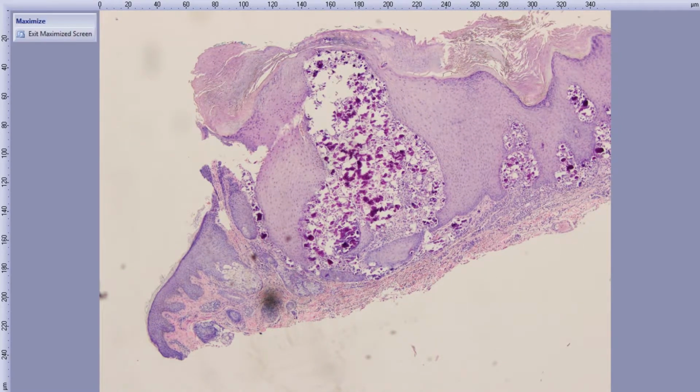In this particular case, there's an entity that occurs mostly in young kids, maybe teenagers, where primarily in the head and neck area, they get a random deposit of this calcium. And somebody, OSU typed it in, that's correct. It's a subepidermal calcified nodule. So that's a known clinical entity that shows calcinosis cutis.